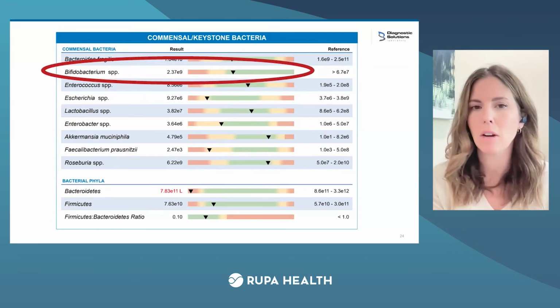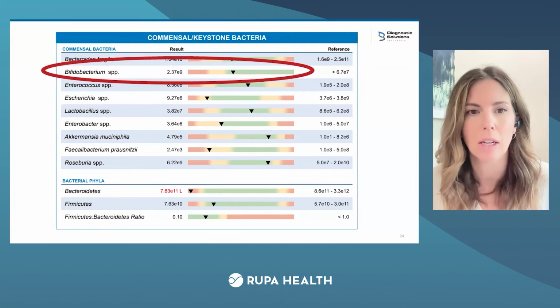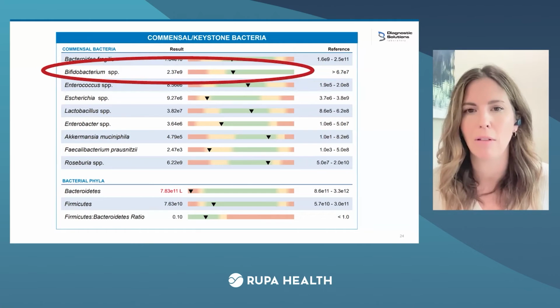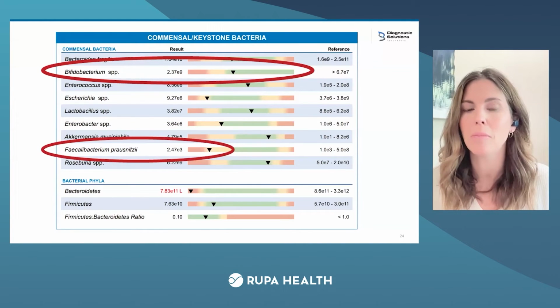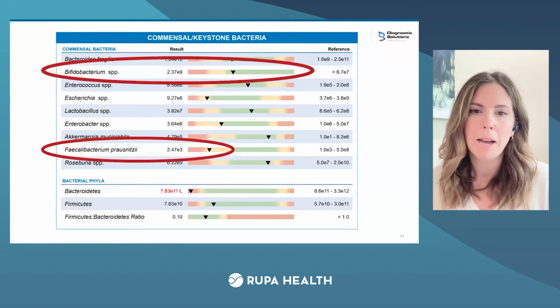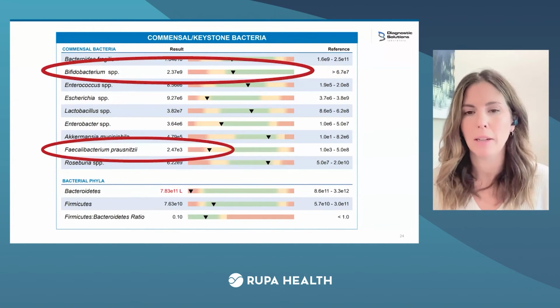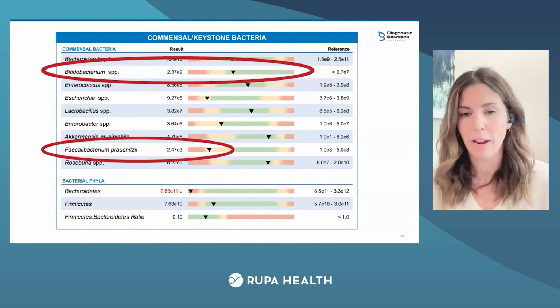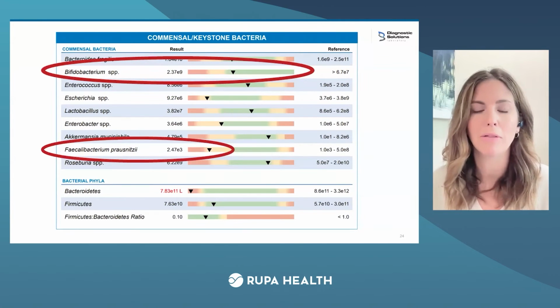So we're looking at this in the context of pediatrics, in the context of a child with compromised barrier function, because bifidobacterium is so integral for the health of the gut lining and for the health of the colon. Next thing we'll notice here, not completely low, but on the low end, is Faecalibacterium prausnitzii. And this, as Lisa explained so thoroughly, is one of our best butyrate producers. I would like to support this in a child. Often I'll be giving butyrate directly, especially in a case of frank inflammation, like eczema. We do see inflammation, and butyrate is great for barrier function.